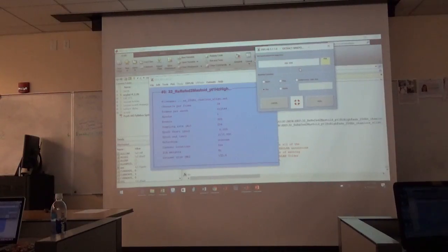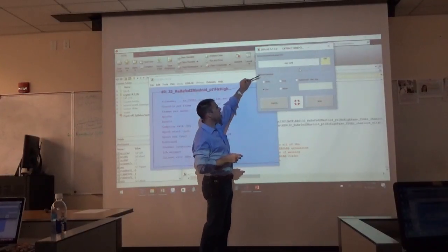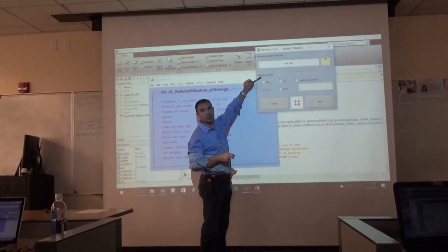Okay, so did everybody switch that from 800 to 1500? The other thing that's important to note here is that it asks us, what do you want to baseline correct to?